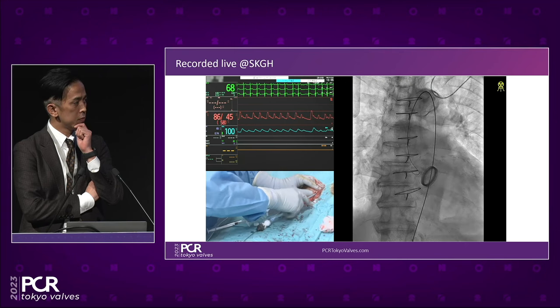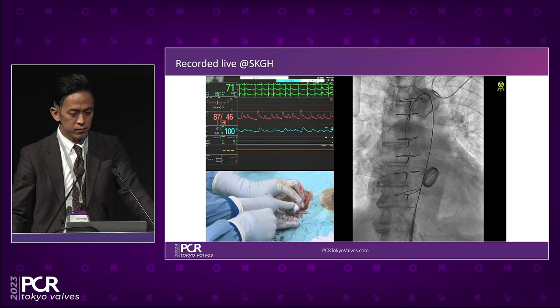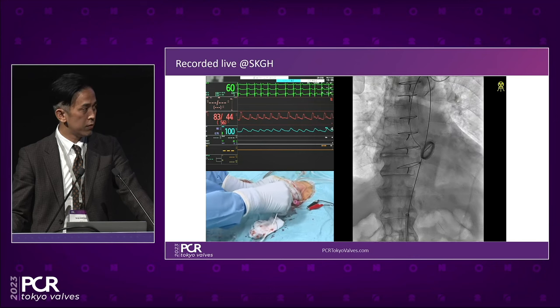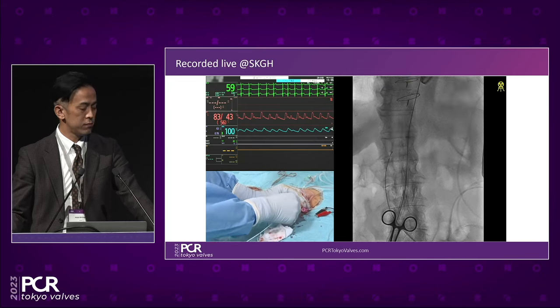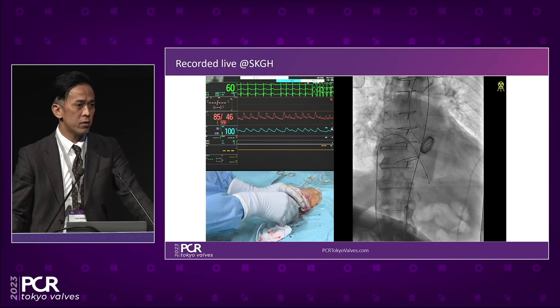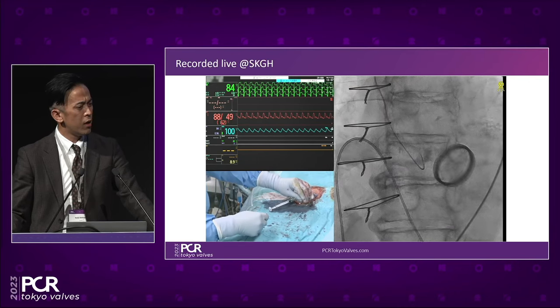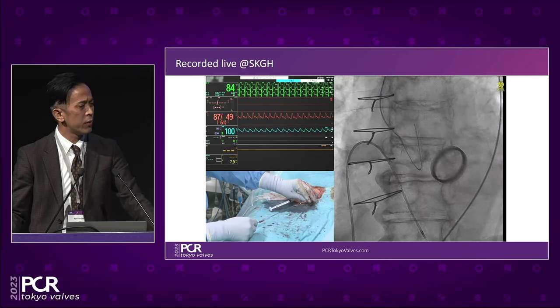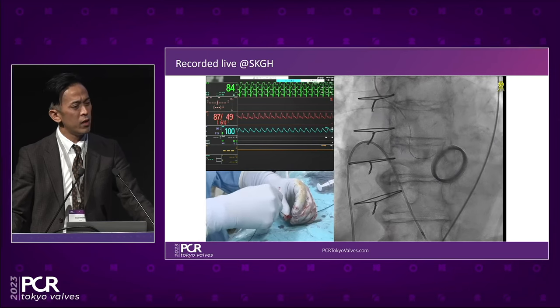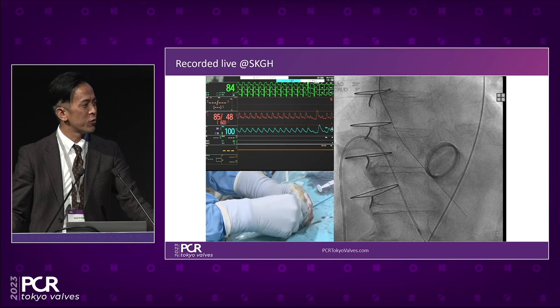So what size sheath are you introducing now? So we chose a 14 French DrySeal for the BAV. So the valve system which you're going to introduce in a second is comparable with the 14 French sheath? Yeah. So do you usually use an integrated sheath? Sure. In almost 60% of cases we use the integrated sheath, and we also tend to use Navitor for very tortuous anatomy and calcified access. So sometimes we use a 14 French DrySeal or eSheath to do BAV.